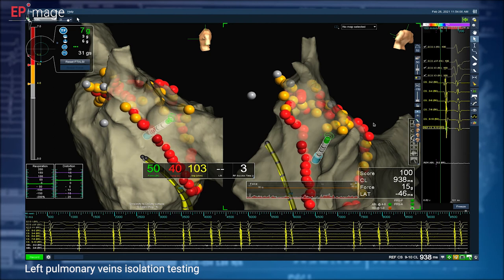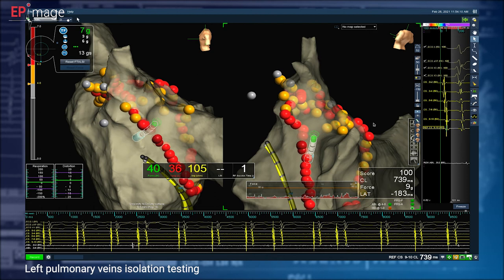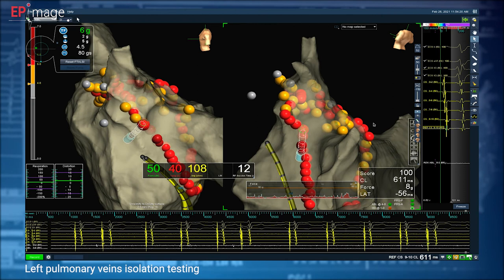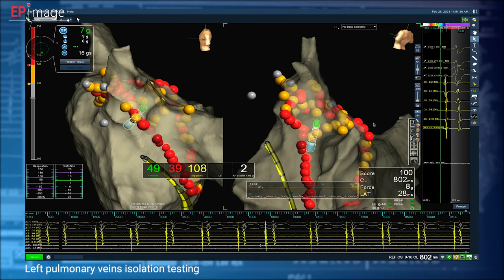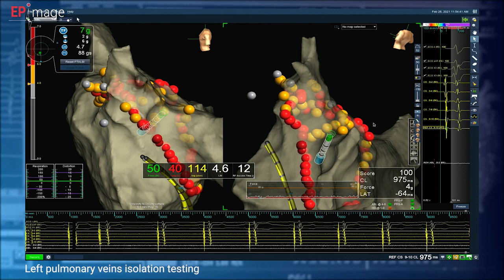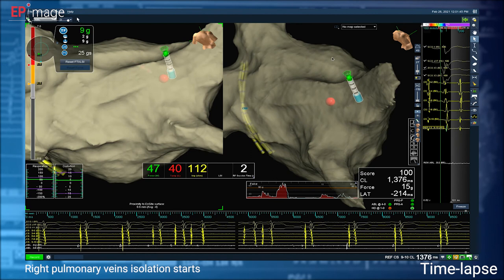So, in fact, with tachycardiomyopathy. At the moment we are just looking for any signals in the left carina, just to be sure that we are not leaving any signals or any gaps in the carina. I noticed that the more antrally I ablate, the more often I have to check the carina and sometimes add some extra applications in the carina. In this particular patient, I decided to close the carina fully, just to be sure that even if any single vein reconnects, the other vein will still be isolated, hopefully.